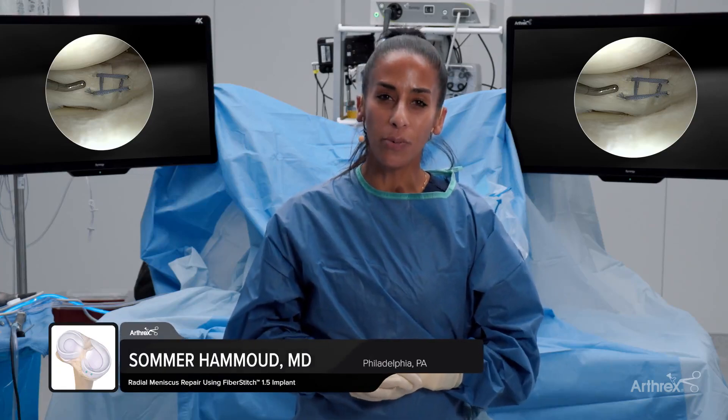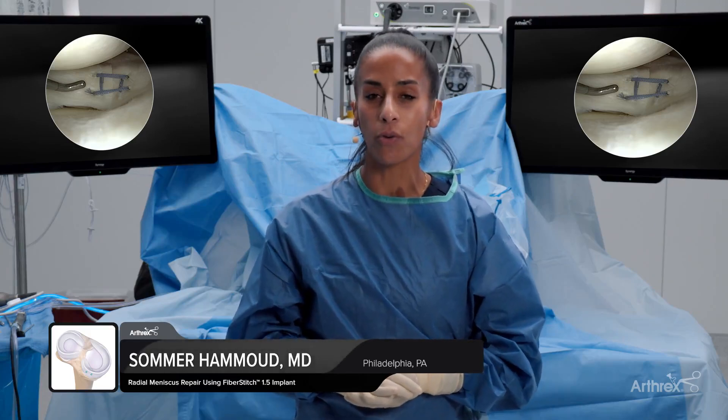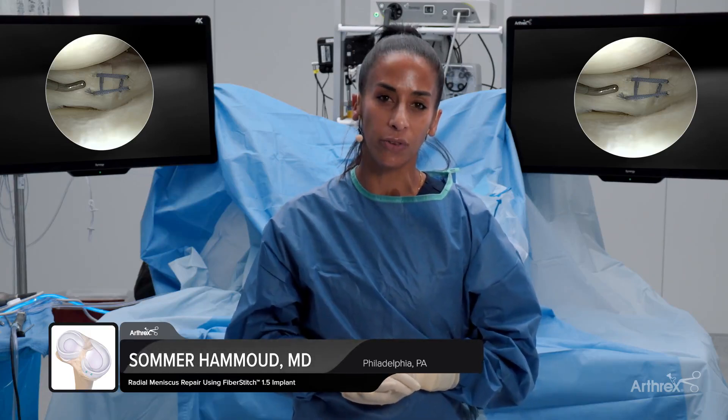Hi, my name is Summer Hamoud. I'm from the Rothman Orthopedic Institute in Philadelphia. Today we're going to demonstrate the repair of a radial meniscus tear utilizing the hashtag suture configuration.